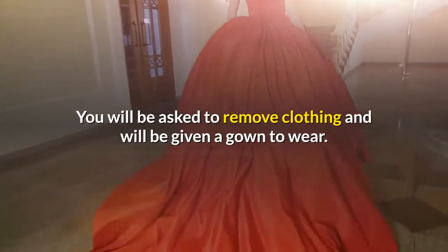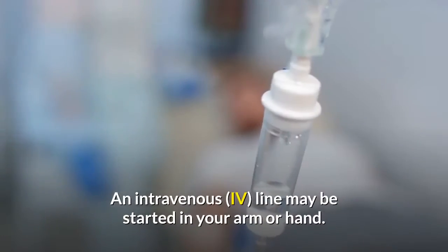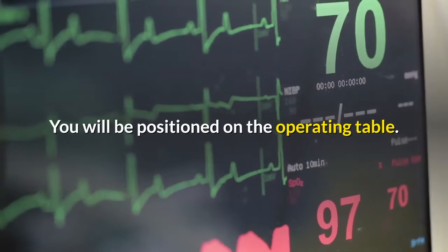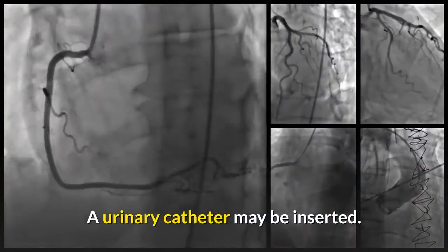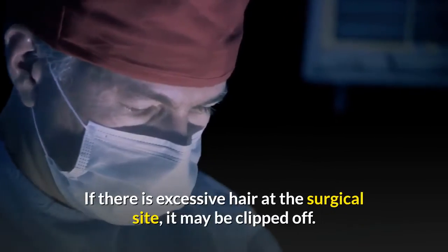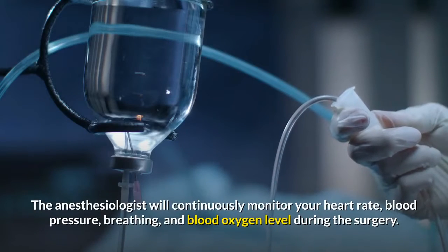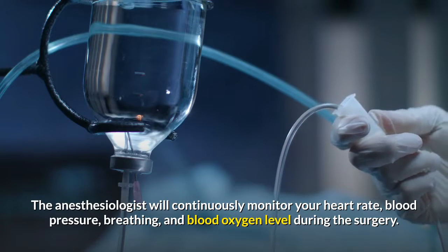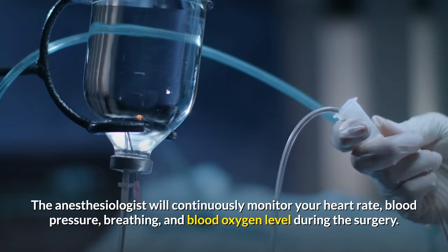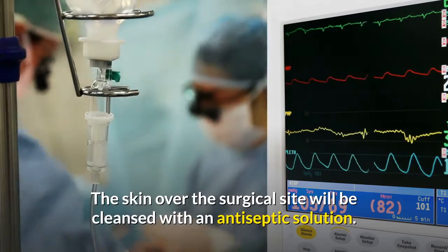You will be asked to remove clothing and will be given a gown to wear. An intravenous, IV, line may be started in your arm or hand. You will be positioned on the operating table. A urinary catheter may be inserted. If there is excessive hair at the surgical site, it may be clipped off. The anesthesiologist will continuously monitor your heart rate, blood pressure, breathing, and blood oxygen level during the surgery. The skin over the surgical site will be cleansed with an antiseptic solution.